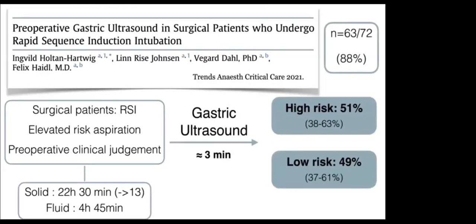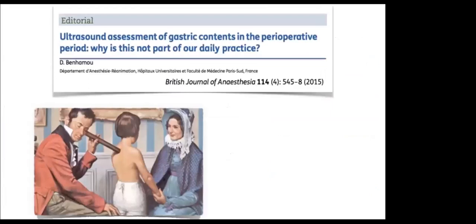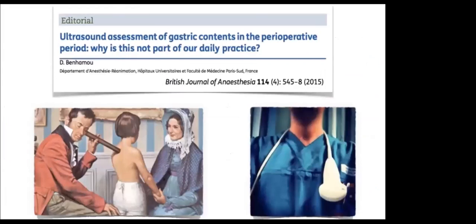This is a proof of concept that maybe by doing gastric ultrasound, you can determine beforehand the risk of aspiration and may change your airway management. In the past, medicine was difficult to incorporate different tools. I believe gastric ultrasound and beyond that, point of care ultrasound can help us in our daily practice.